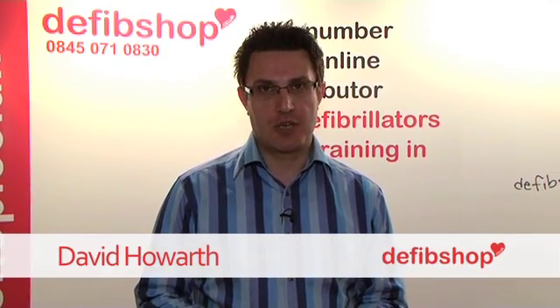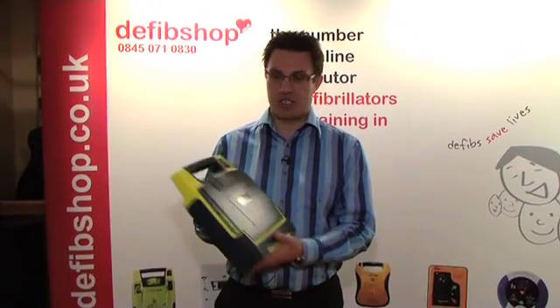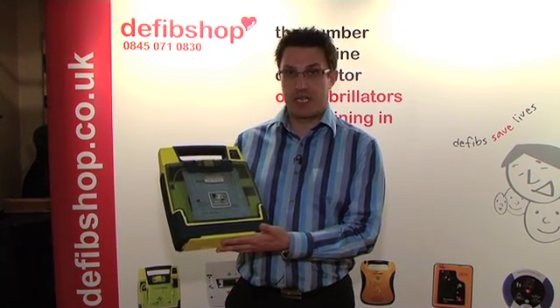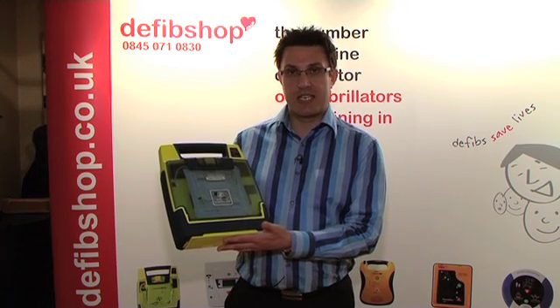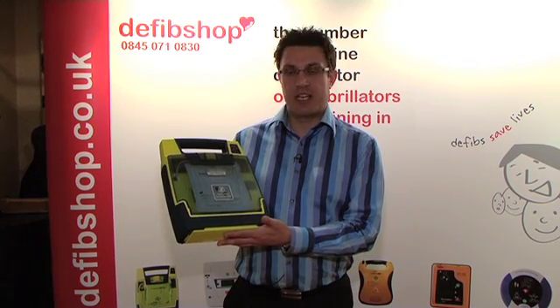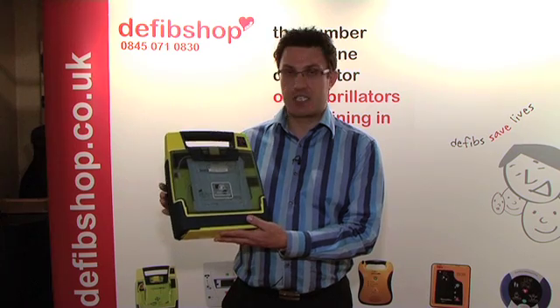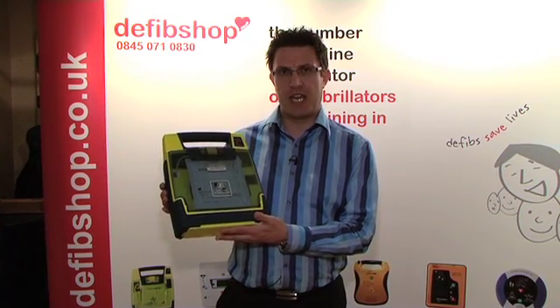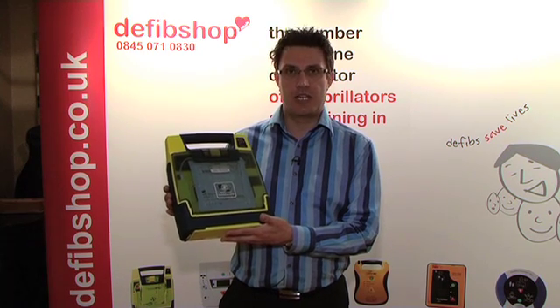Welcome to this short video demonstration from defibshop.co.uk. On this particular demonstration we are showcasing the Cardiac Science Power Heart G3 defibrillator. This defibrillator comes in various versions: semi-automatic, fully automatic, and the Plus. The Cardiac Science Power Heart G3 is the sole distributor for the national defibrillator program in the UK and has been since 2005.